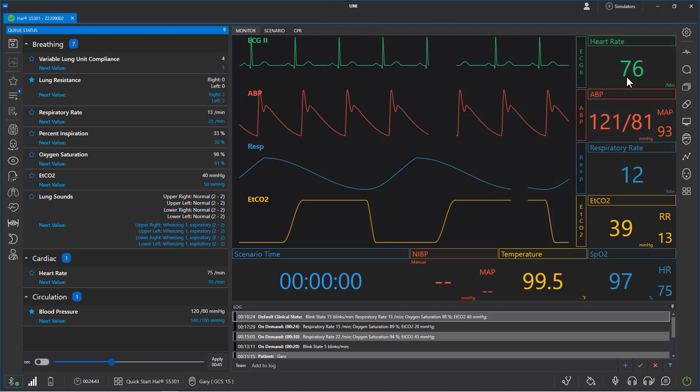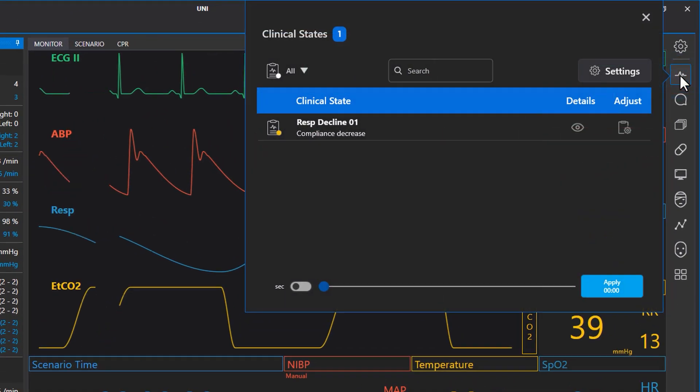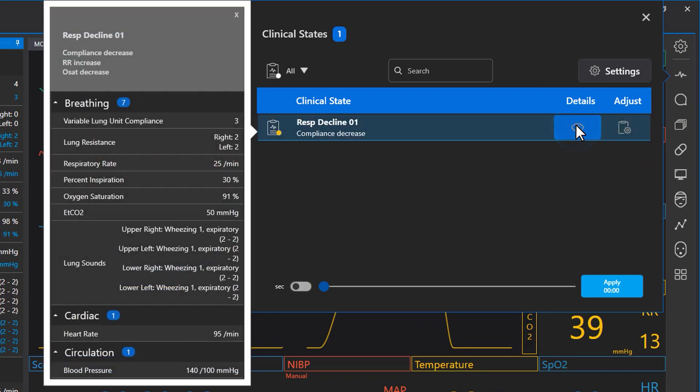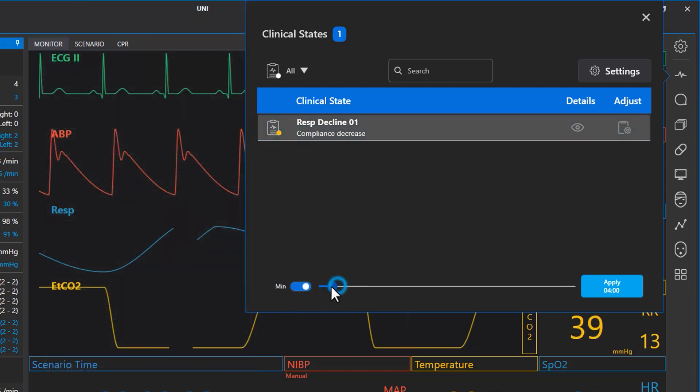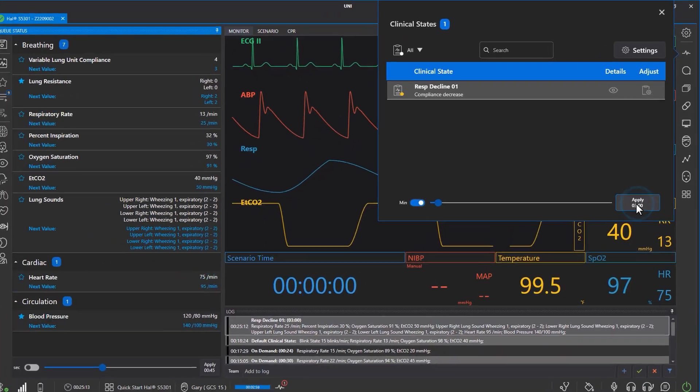To access clinical states, open the menu on the right. You can see the details you programmed previously by clicking the details icon. When you are ready, set a time interval and press apply to trend the changes.